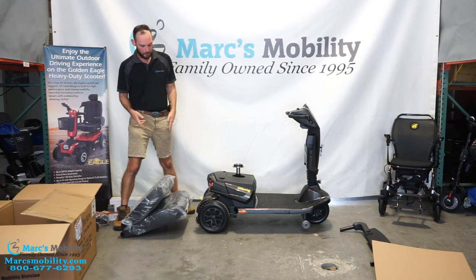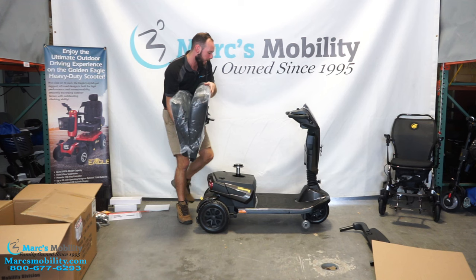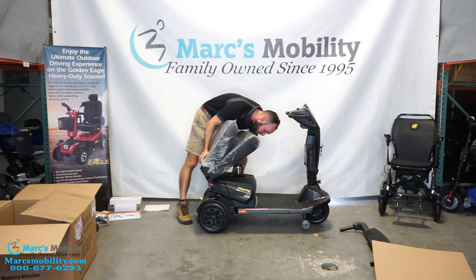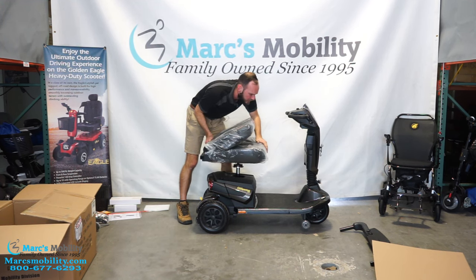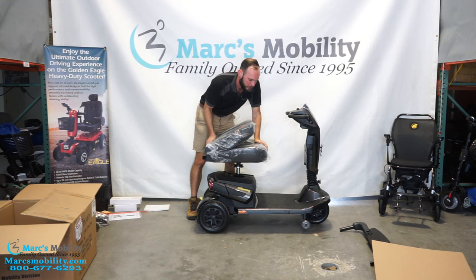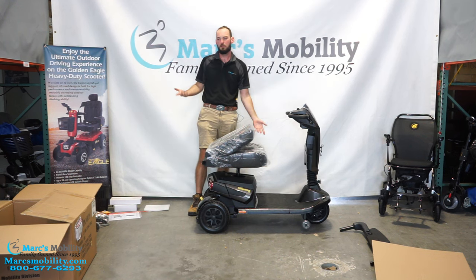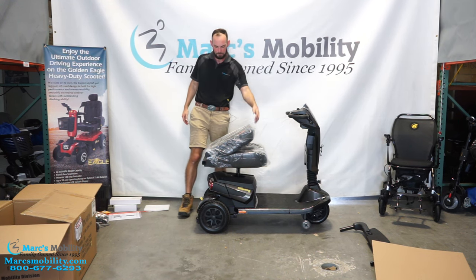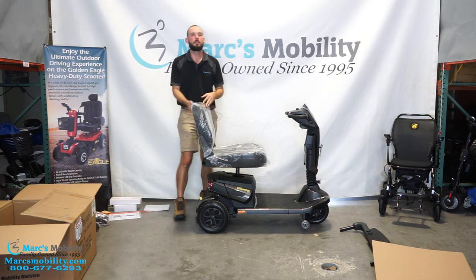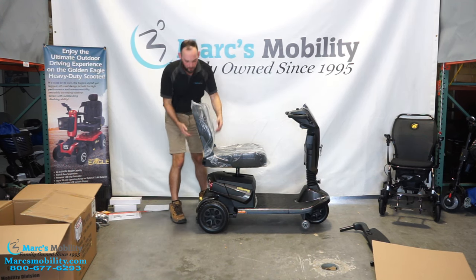Now we're going to put the seat on the unit. I'm going to grab it from the back, then this post just slides in here. It is kind of a tight fit — you've got to line it up right and kind of push it in, so it does take a little bit more effort. Same with removing it, it just seems to fit really tight in there. But that's how you mount the seat on.